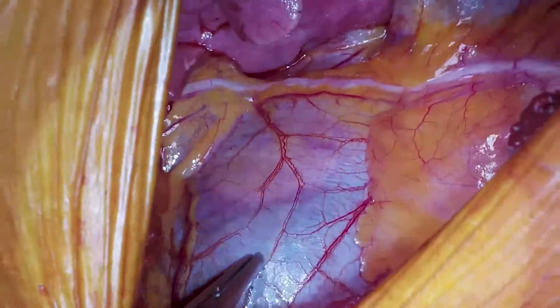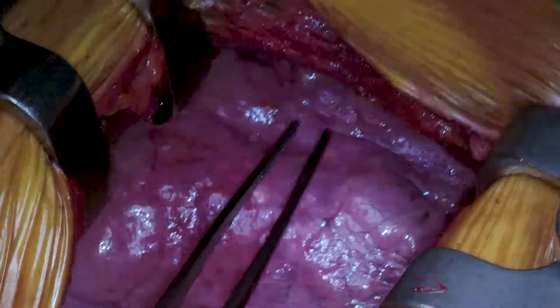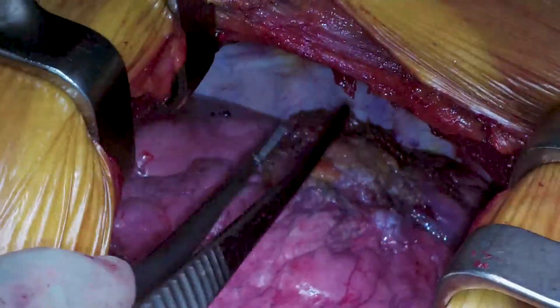Here is a bit of chest anatomy. You can see the phrenic nerve running very nicely over the pericardium, the diaphragm down below, and up here is the right upper lobe which has the tumour on it, with some adhesion to the lower lobe but not many.